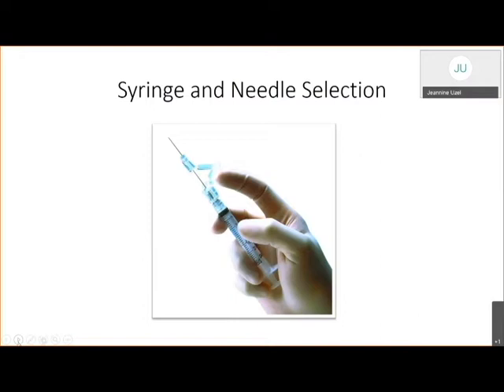Personnel who will be using these products should be involved in evaluation and selection of these products and should receive training about using these devices before using them in the clinical area. Some syringes and needles are packaged with an expiration date. This can be a consideration when ordering injection supplies. Never administer vaccines from the same syringe to more than one patient, even if the needle is changed.